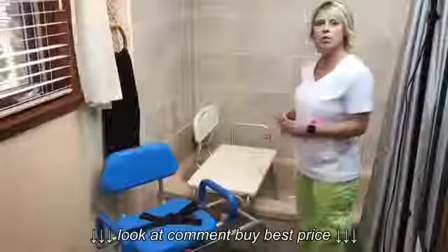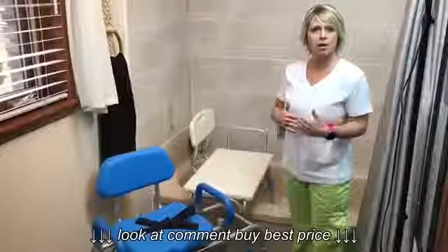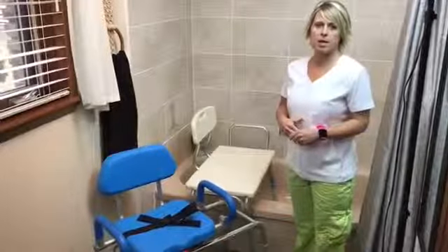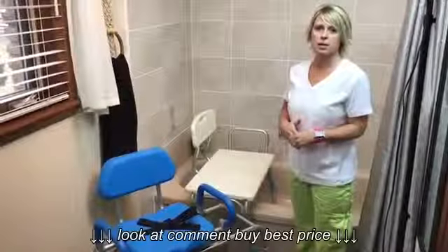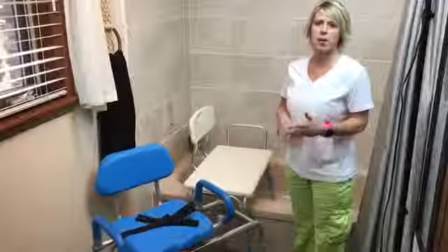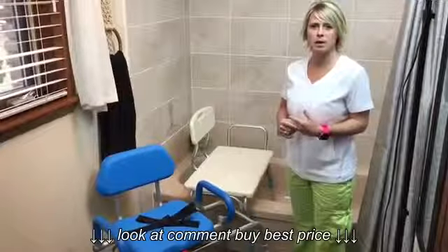Hello. Today I'm going to teach you how to set up and use bath transfer benches. I'll introduce myself. My name is Dawn. I'm a nurse and also a safe patient handling specialist, and I've been teaching healthcare professionals for over 20 years how to do safe patient handling in hospitals, nursing homes, and private care across North America.